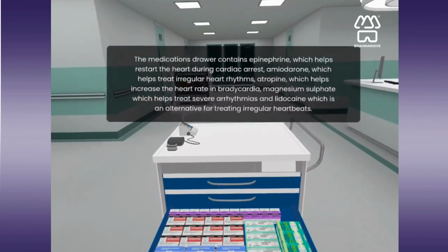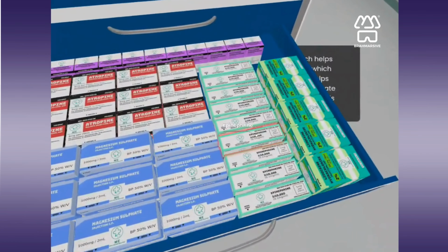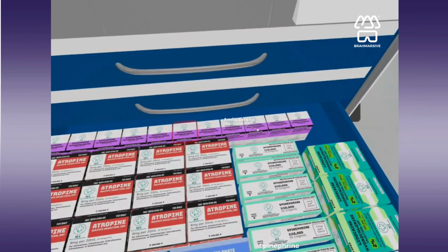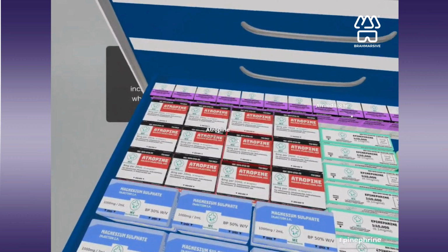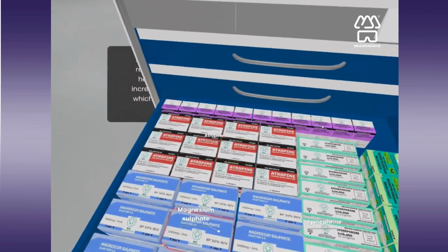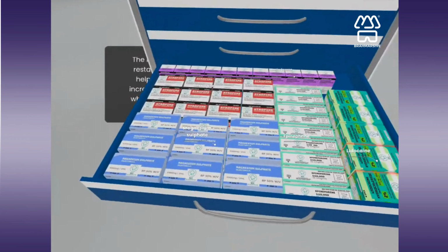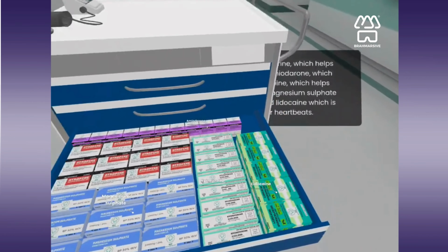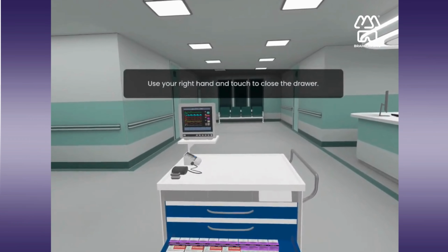The medications drawer contains epinephrine, which helps restart the heart during cardiac arrest, amiodarone, which helps treat irregular heart rhythms, atropine, which helps increase the heart rate in bradycardia, magnesium sulfate, which helps treat severe arrhythmias, and lidocaine, which is an alternative for treating irregular heartbeats. Now, touch the glowing handlebar to close the drawer.